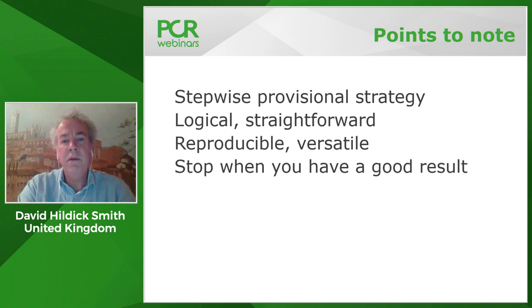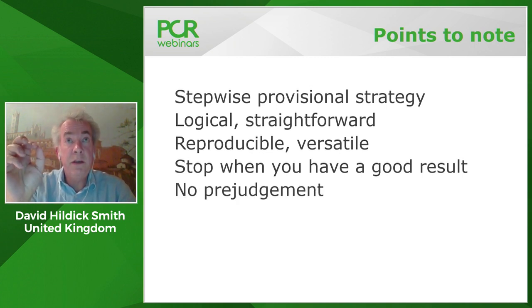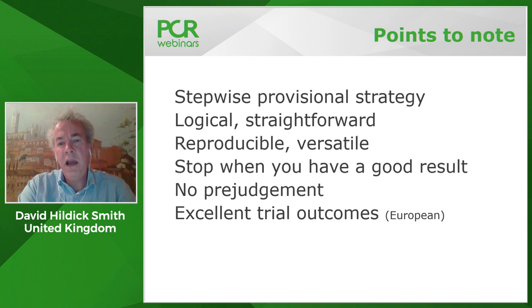And that means that you haven't prejudged the issue. You haven't decided at the outset exactly how it's going to behave during the case. And that means that you have a very versatile, highly logical, stepwise approach to bifurcations, which will stand you in very good stead as an interventionist. And actually, the outcomes, when you look at the trials over the 10 years from the UK and the Nordic groups in particular, have really been excellent. And you will hardly ever find that you have regretted taking this approach to a bifurcation. It will stand you in very, very good stead.